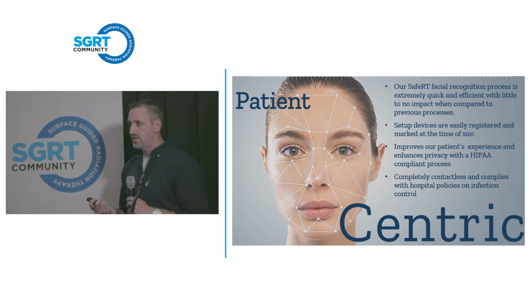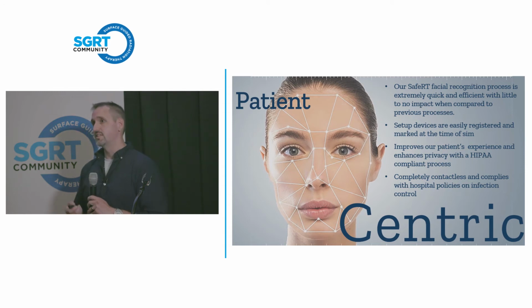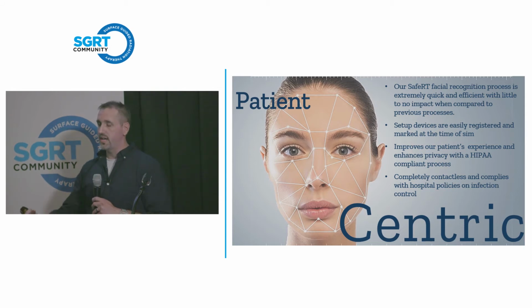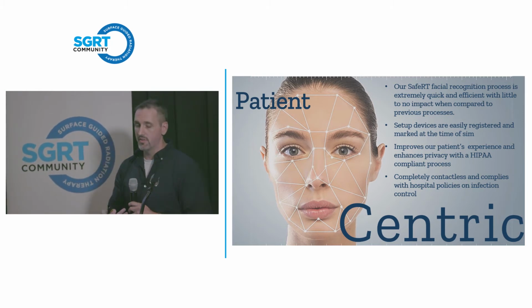It improves the patient experience. We have a lot of patients who don't want us to use their names in front of other patients. We also have a lot of patients who have very similar or exactly the same last names because of where we are. And so it's a very HIPAA compliant system. We're allowed to walk up to them with the handhelds. We can see them on the picture on the handheld. We can say, could you come with us? And then if we get to a more private environment, we can have more of a conversation with them.